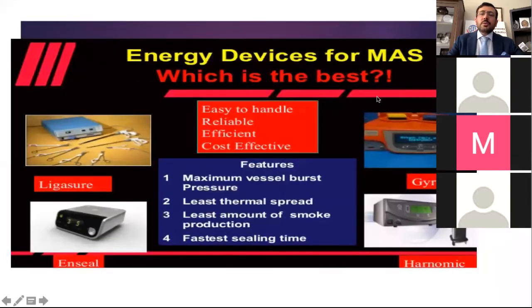Energy devices: which is the best depends on your unit, and also on your surgeries. Which surgery are you doing? Easy to handle, reliable, efficient, cost effective. These are some points that you must consider, especially my Tanzanian participants and colleagues.